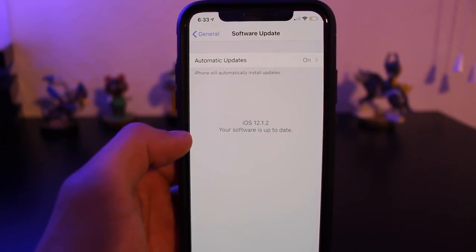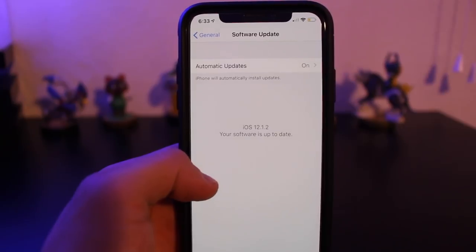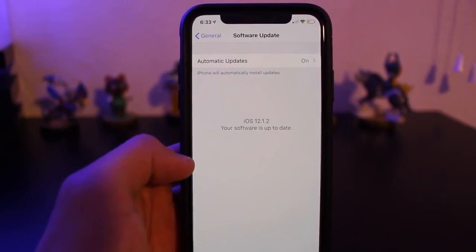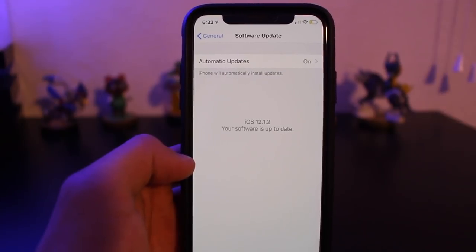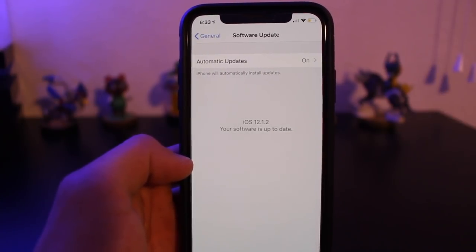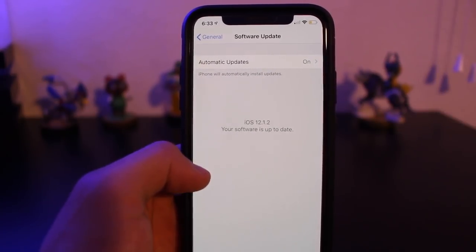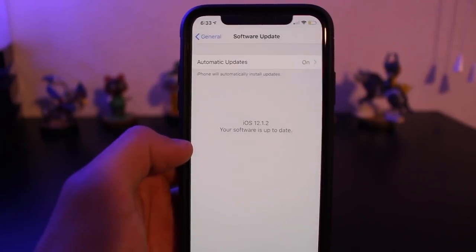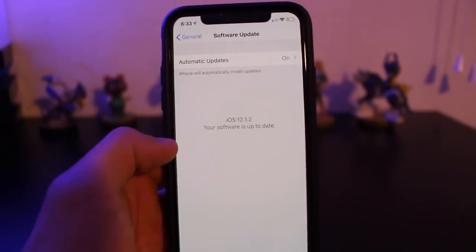So if you want to enable this during the time of making this video, you need to either enroll for the developer beta or the public beta. The public beta literally only takes a few seconds to enroll, so if you really want to unlock this now, I'll leave a link to an article in the video description down below because the process literally only takes a few seconds.